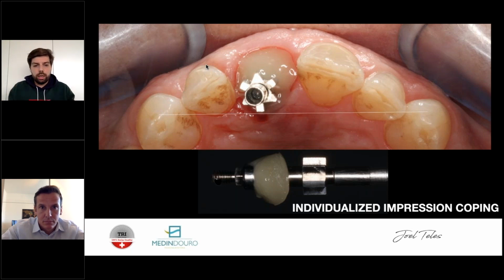I will do a Maryland bridge, adhered to the adjacent tooth, trying to create the same principles, but only glued to the adjacent tooth, or I'll do it like this, screw-retained, and don't unite them to the adjacent tooth. As for the design of the temporaries, you do them always out of occlusion.